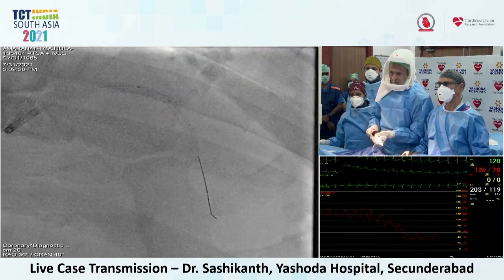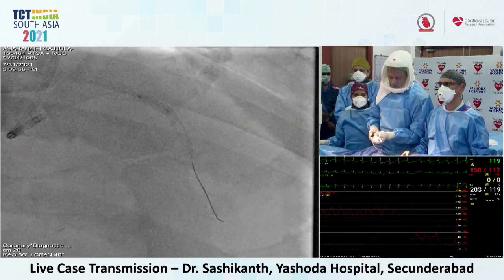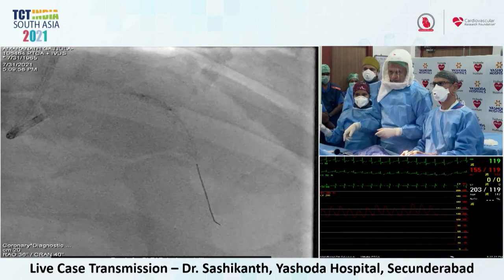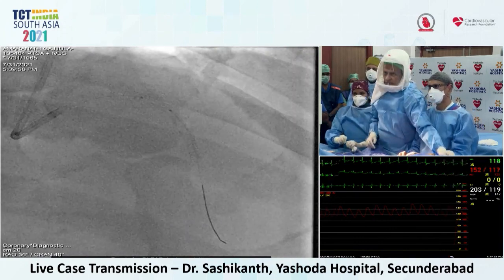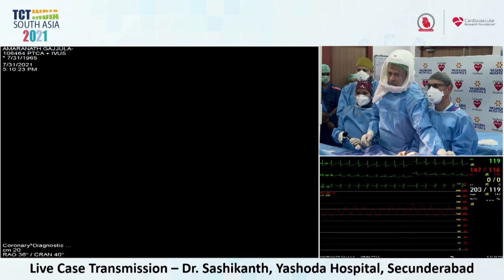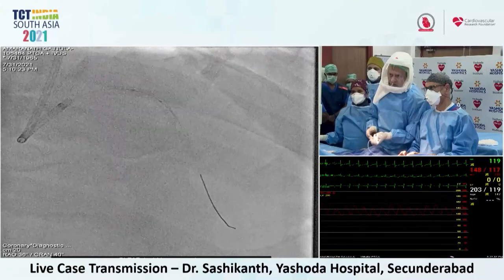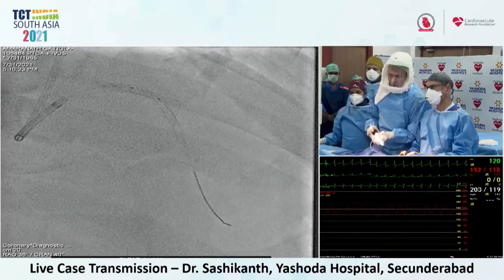Okay. Now you have probably 10. Give much more, 10, 12? Yep. Okay. It's probably not enough. You have to go with a higher pressure. Yeah, we'll just do an IVUS run. Going one more inflation. Okay, I'm going to 12 atmospheres.